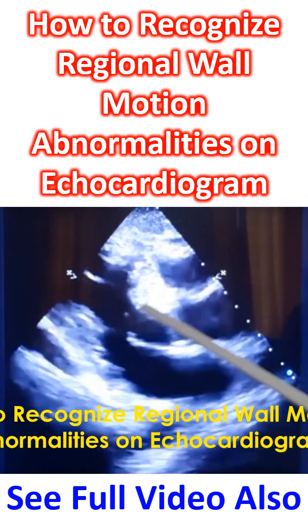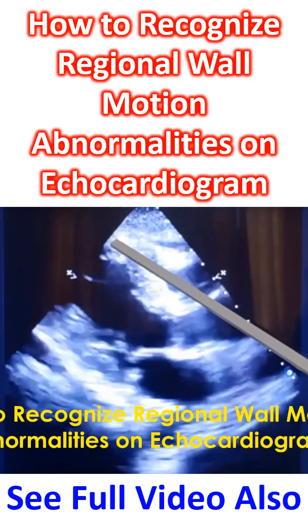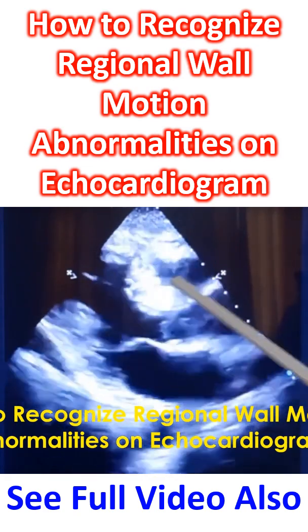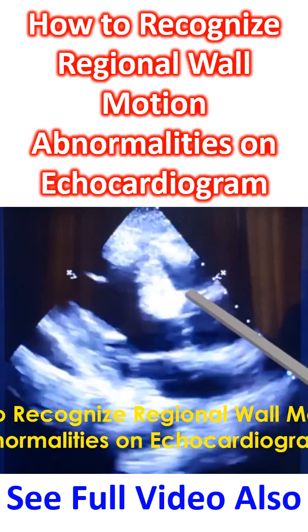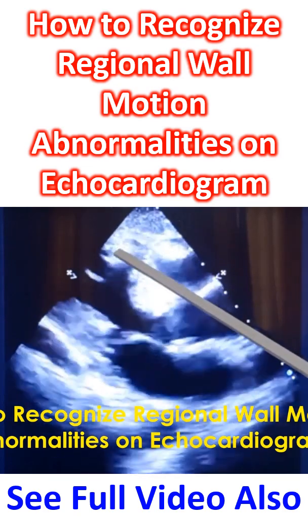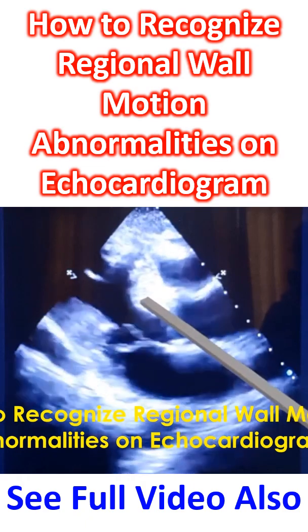But look at this portion — this portion of the septum is not contracting well. That is a regional wall motion abnormality. Decreased contraction is known as hypokinesia.